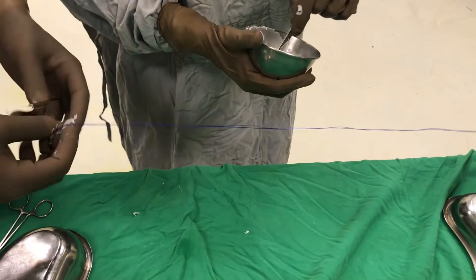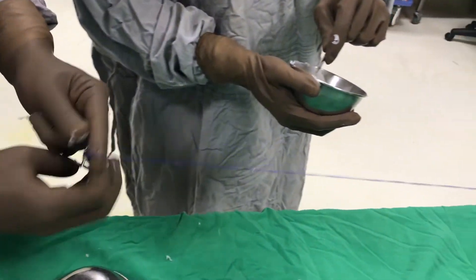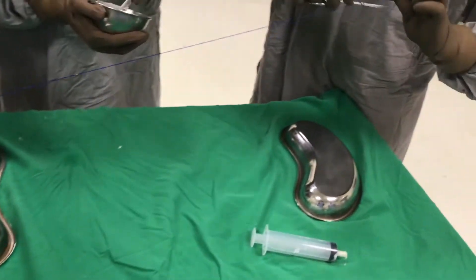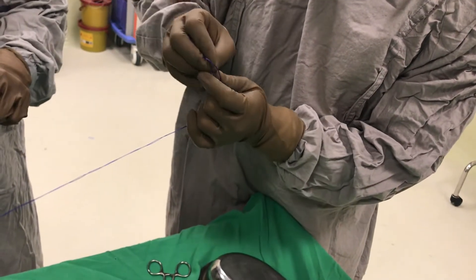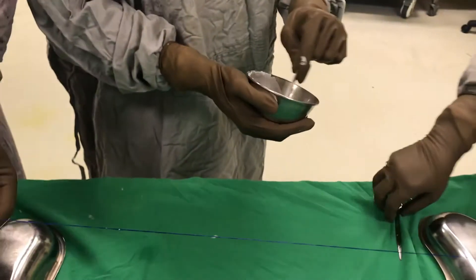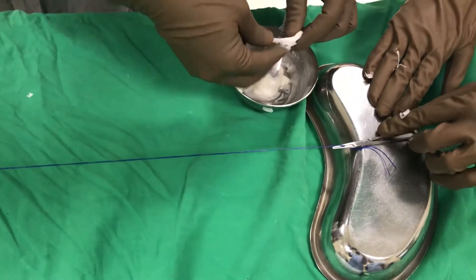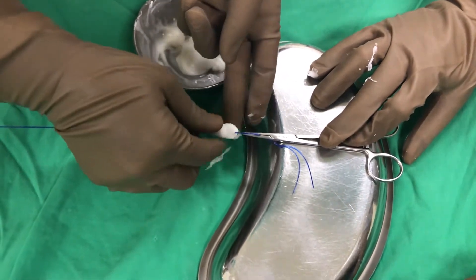We have locked both of the sutures at the corners with knots so they don't disintegrate — they are locked firmly and tightly with three throws so they are kept taut together and the beads can be applied easily. The consistency is now good enough and this is the right time to apply the cement onto the prolene sutures to form beads. Beads should not be too big — they should be around one centimeter in size, and olive shapes are preferred.